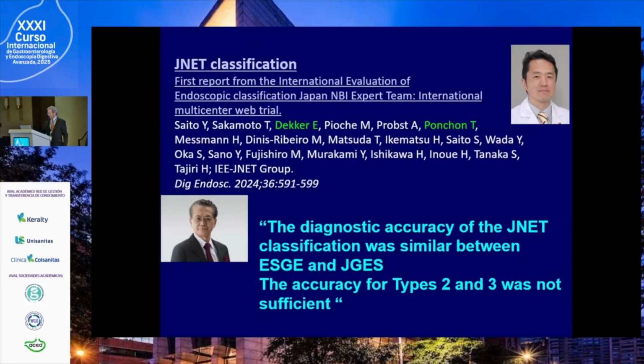In fact, these are our Japanese colleagues, and we conducted this study with Evelien Dekker from the Netherlands. And in fact, there was no difference between Japanese colleagues and European colleagues. The Japanese colleagues, when we work with European colleagues, are not so good, finally. The truth, they are not so good. And accuracy for type 2 and 3 was not sufficient. Okay, so don't rely so much on JNET. Don't rely so much on analyzing the polyp. Don't rely, okay?